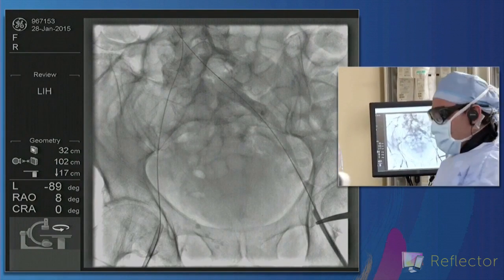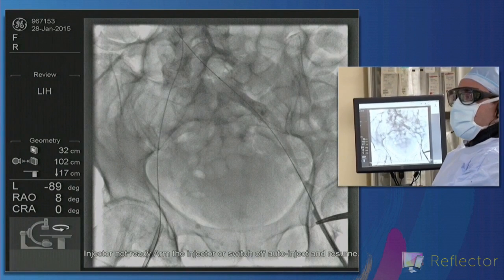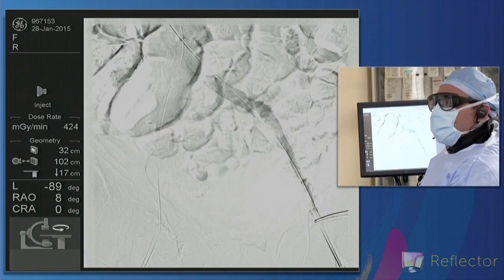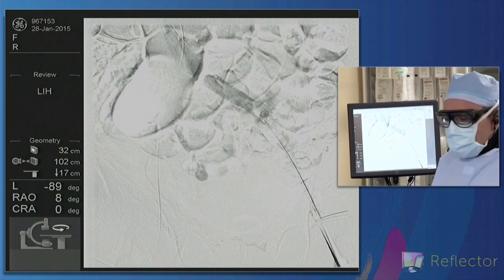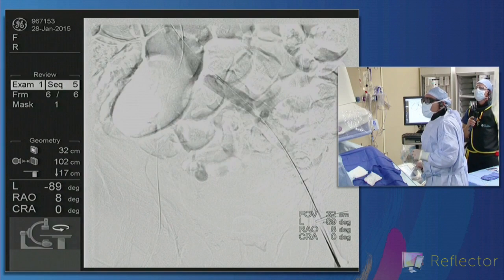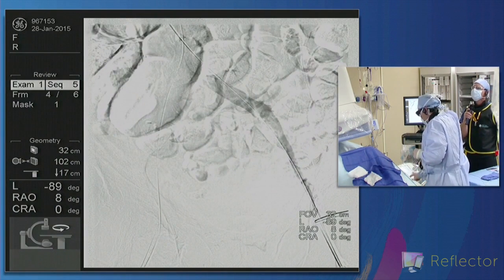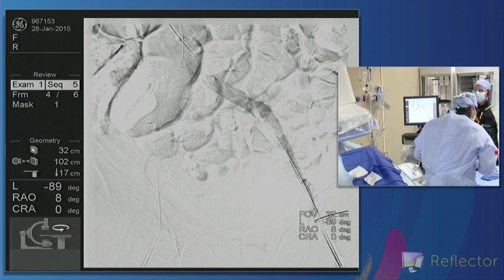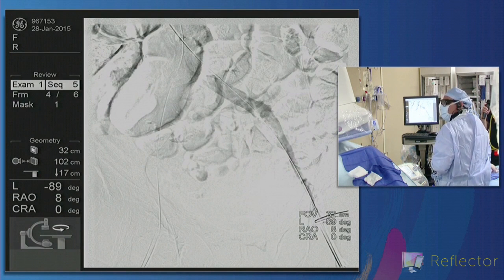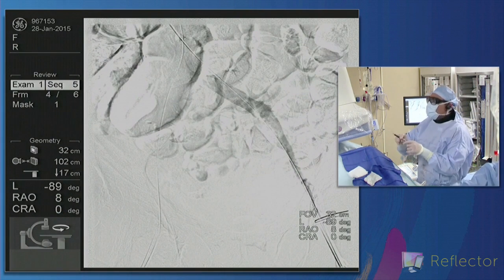Peter, what would you put here? We would probably not put a wall stent if possible because of our difficulties. Case doesn't use them at all and he highlighted why, because you cannot tell where the distal end's going to land. This is one that I might do from up and over. I mean, typically we don't do it that way, but in this case, I might consider putting it in from the right. If a wall stent was all I had, that's how I would do it. You know, I like the characteristics of the stent. It's just the deployment difficulties, like you said.